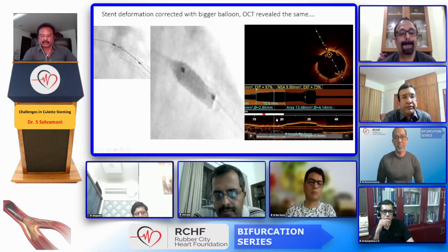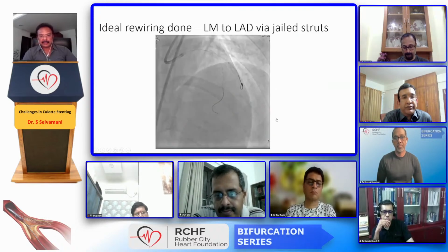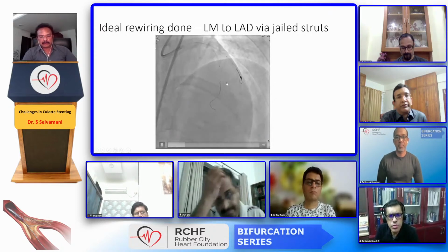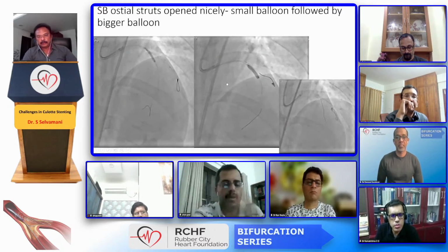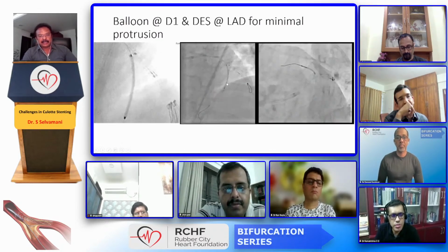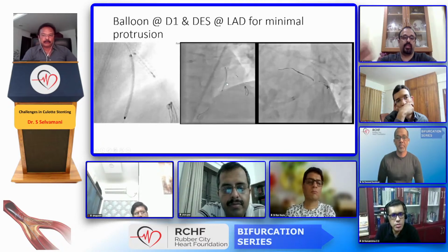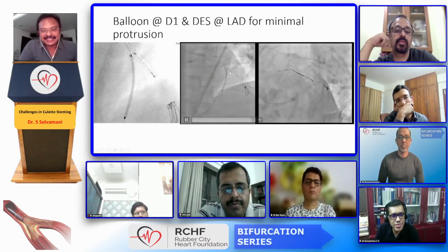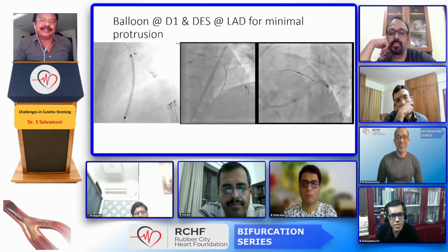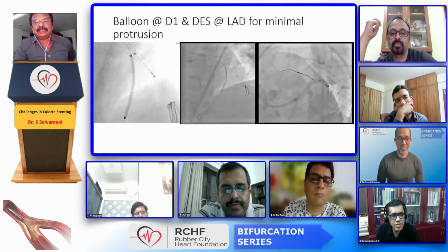And then what I did is I recrossed, and recrossed here into the LAD. And this was probably an ideal wire crossing. And then the balloon moved here. So I took the balloon there and dilated there. And here I did not want to go ahead with Culotte, because I would have to again take out the wire and recross. So what I did is I just modified it into a T.